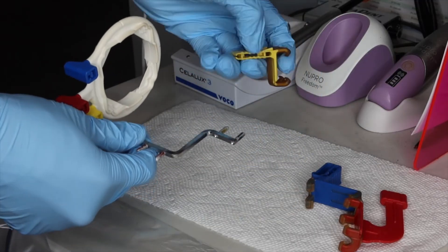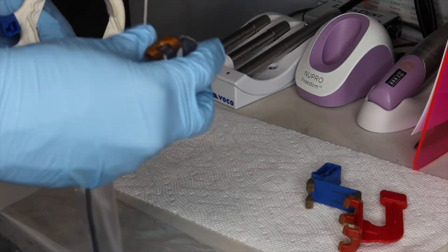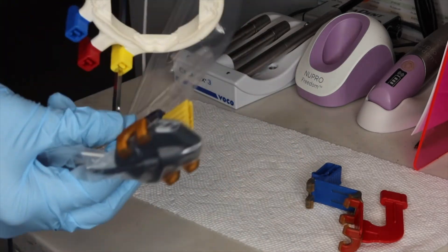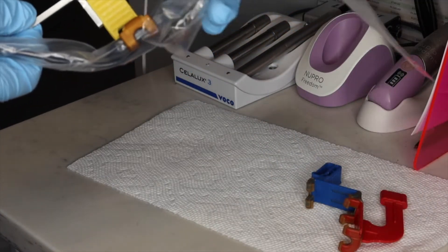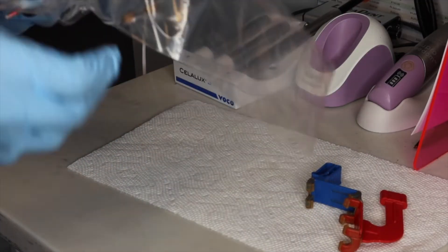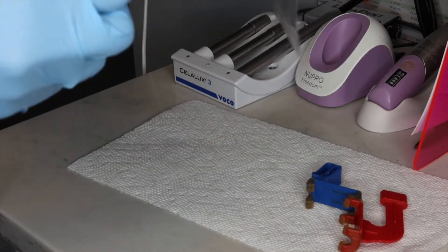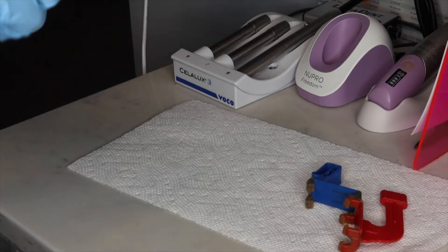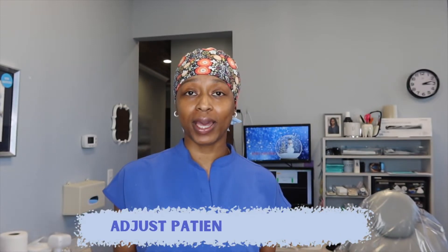We have a lot of extra bite tabs so we can sterilize between uses. I don't use a protective covering over the actual bite tab — only over the sensor, since that's what I reuse with every patient. If your office has plenty of extras, you may not need the protective slip. I've found that not using the plastic slip makes me go a lot quicker, because sometimes the plastic gets jammed and it takes a long time to flip it and move to a different quadrant.